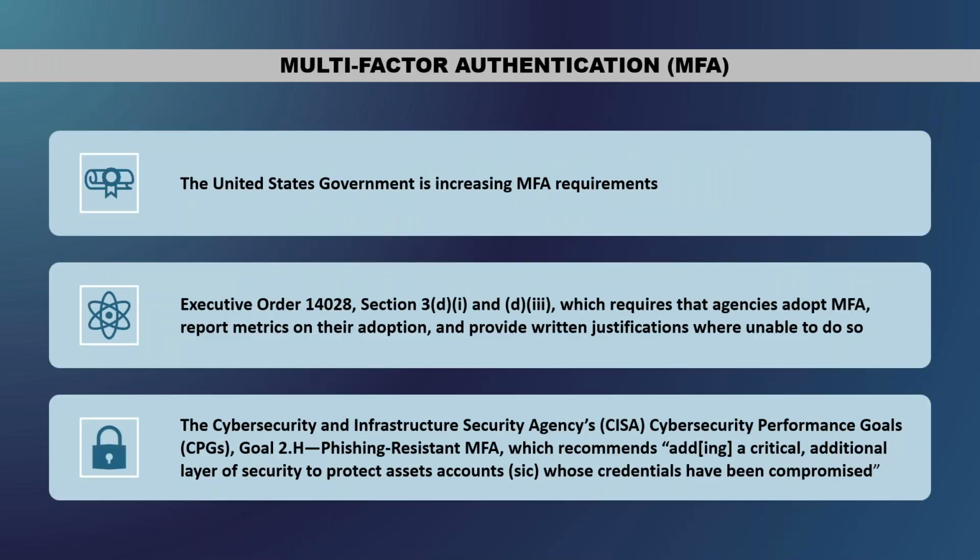Next. Okay, so when I talk about MFA, this is going to be big because obviously the United States is increasing MFA requirements, right? There's an executive order requiring all systems to be multi-factor authentication. We as healthcare individuals know that not every single medical device can have or support MFA. So what I usually tell IT or whoever's enforcing this is to think of your healthcare system like a kingdom, right? And all of us have little castles for the medical equipment.